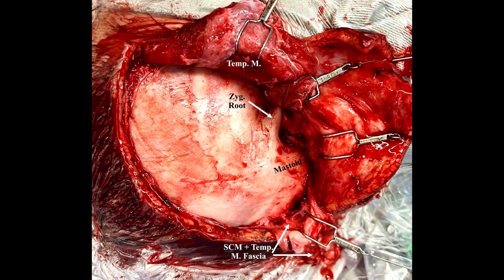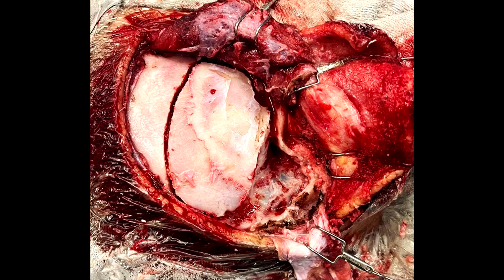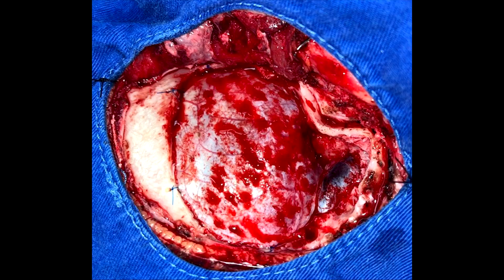Here we have the bone exposure. The mastoidectomy is performed first to identify the sigmoid sinus before performing the craniotomy. In this case, only the proximal part of the sigmoid sinus will be skeletonized, as we need just enough room to slightly mobilize the sinus posteriorly and section the tentorium to increase the working corridor along the basal cisterns towards the lesion.